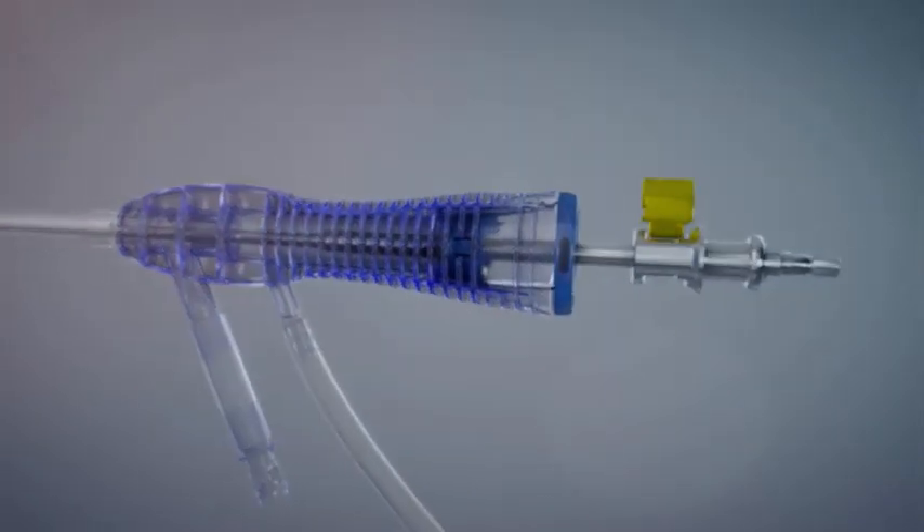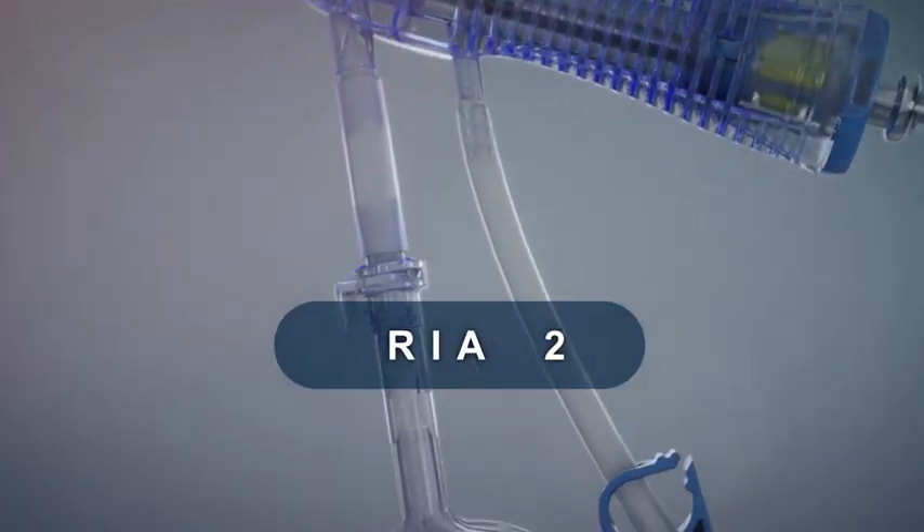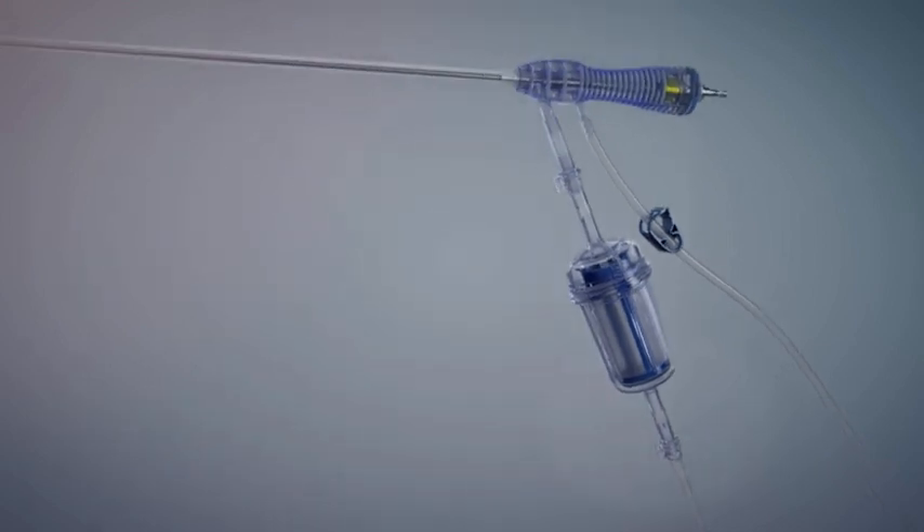DePuy Synthes has developed the next generation reamer, irrigator, aspirator — RIA2 — a reaming and bone harvesting system designed with simplified assembly.